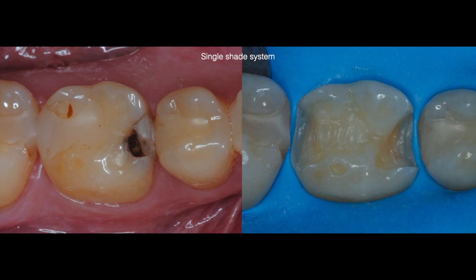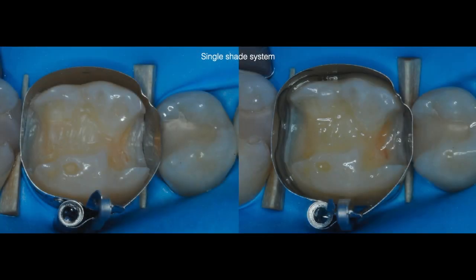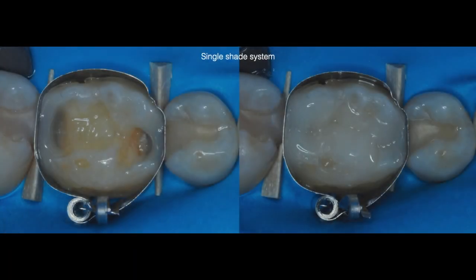Let me show you what this looks like clinically. In this case, I will be using Omnichroma to restore this large class 2 on tooth number 30. After placing my matrix band and wedges, I selectively etched, rinsed, and applied the Universal Bond by Tokuyama, which is a self-cure bonding system. And then completed my restoration using a centripetal technique as seen on the photos.